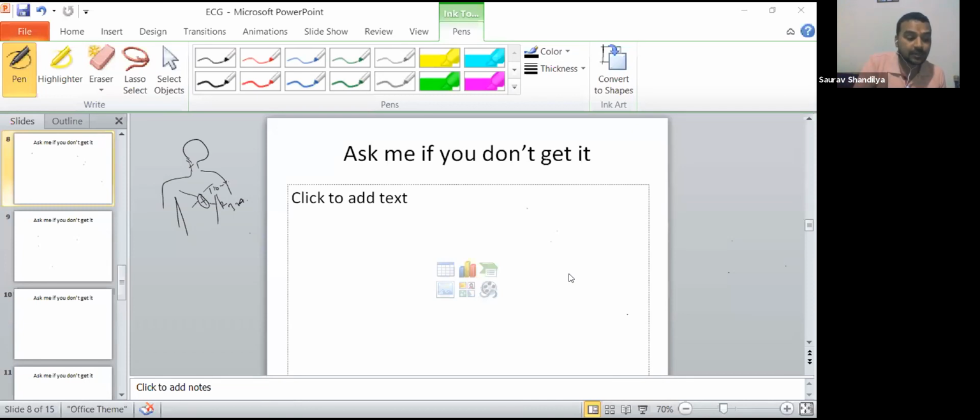But how it is getting recorded. What happens here when you are doing the ECG? I'll tell you one very simple thing. Say for example, I'm showing you one cardiac muscle, very simple, just as a schematic. Don't think that it is a real one, just a schematic diagram. It is positive outside, and inside it is negative. This is the normal polarization.